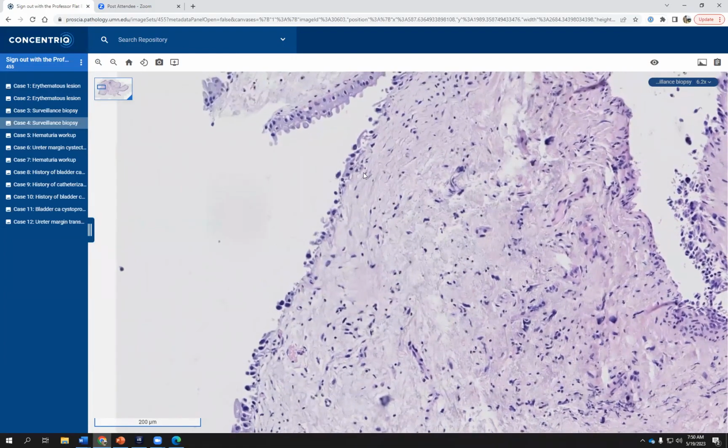And this is a type of carcinoma in situ which denudes very easily because the cell-to-cell adhesion in carcinoma in situ is often lost. Some people term this a denuding cystitis. Denuding cystitis is just another term used by clinicians and pathologists for carcinoma in situ that sheds off the surface, okay?